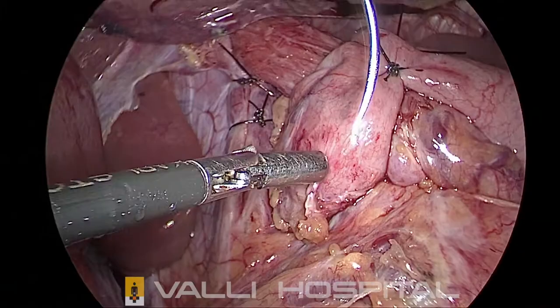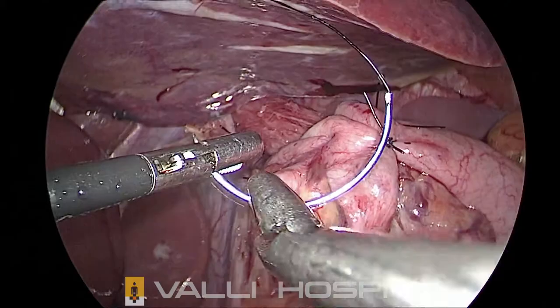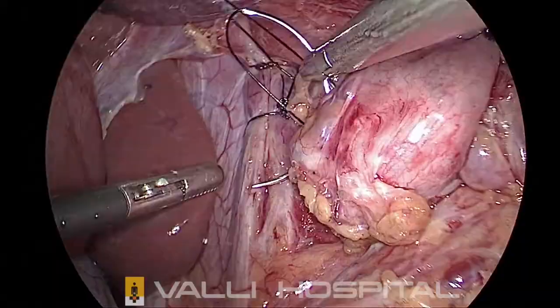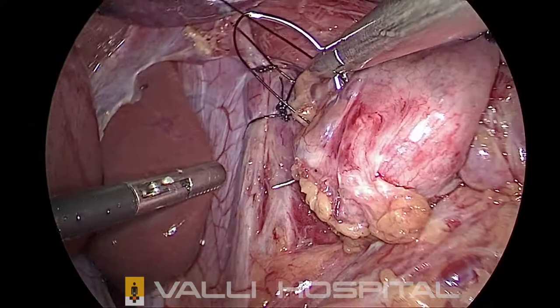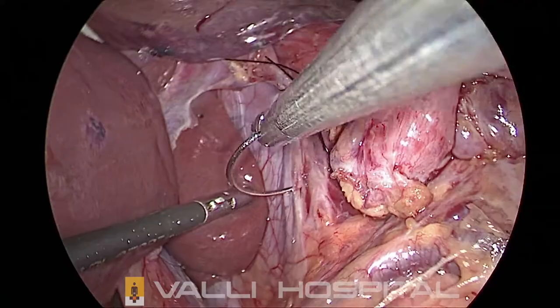Go to an area where there is no blood vessel, and then you take a bite, otherwise it will start bleeding at the end. So now you take a bite from both the crura, because we have stitched up both the crura. Take the bite, don't go too deep. This is just to prevent the wrap from getting inside the chest.